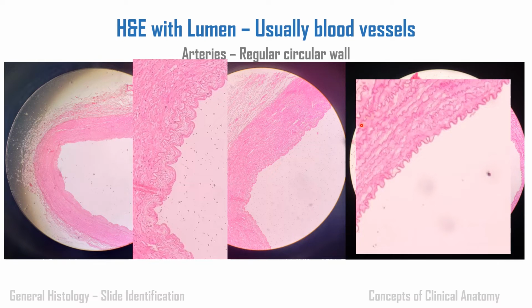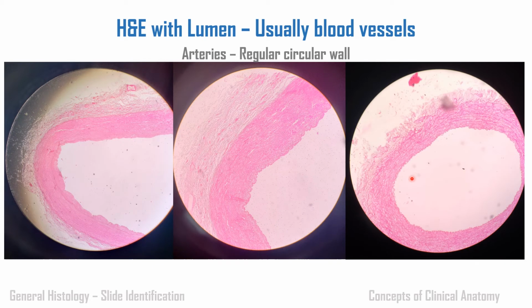So here even though elastic fibers are less, like an odd one out, we can visualize the elastic fiber here. But here we can't visualize the elastic fiber. So that's why this is the feature of a muscular artery or medium size artery. This is the feature of an elastic artery. Let's see in this image itself.